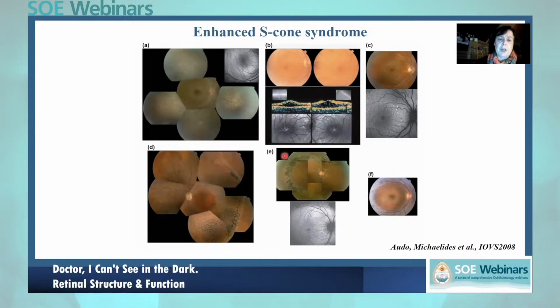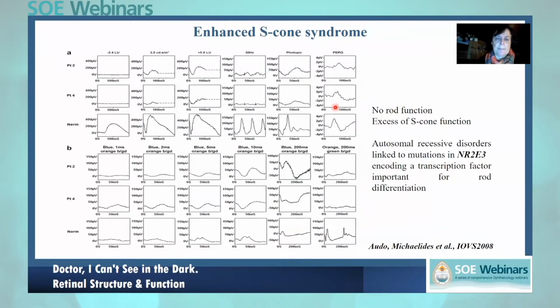The fundus can be variable, with little dots that are hyper-autofluorescent, or when there's pigment migration, it's usually nummular around the vascular arcades. One distinguishing feature, which is very common, is also the presence of cystoid maculopathy, which is important for the visual prognosis.